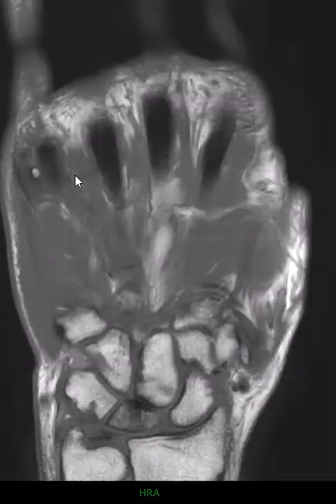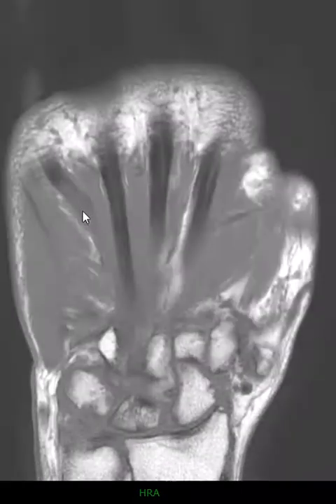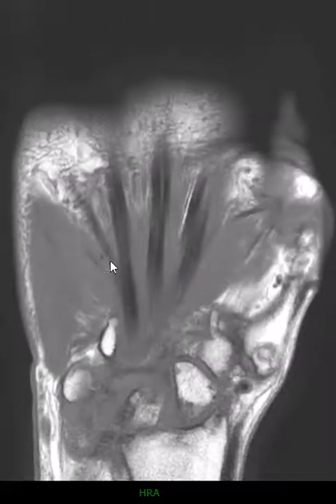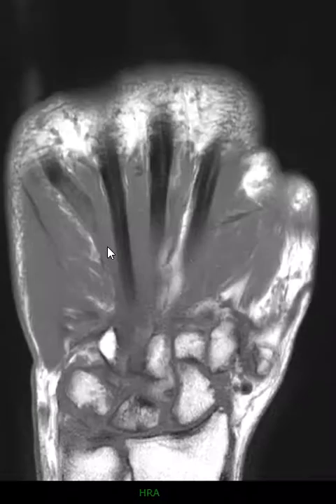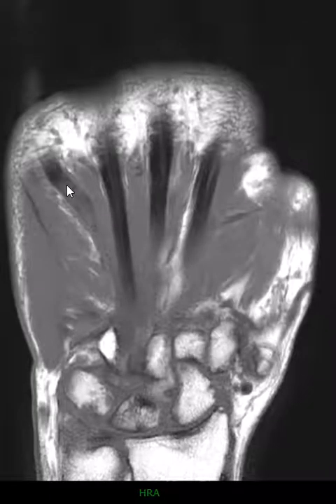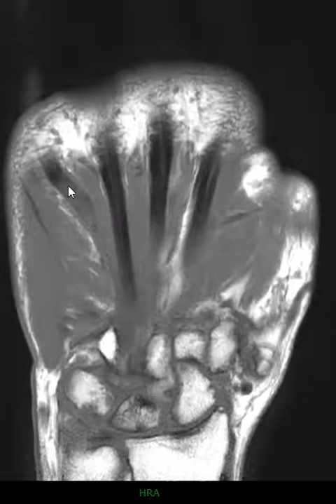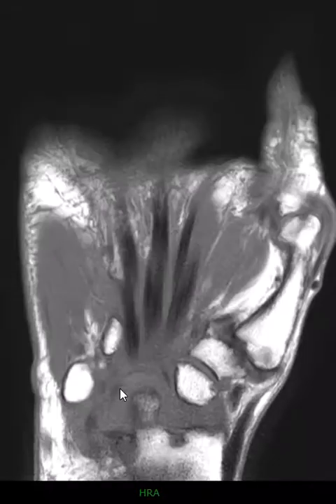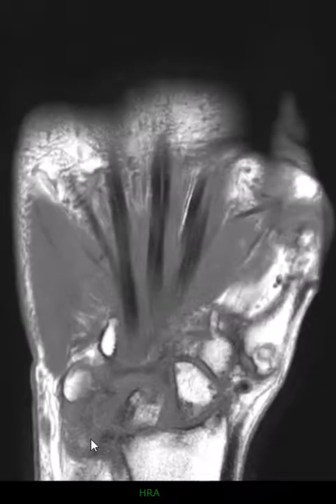And when we get to the fifth one, this doesn't look quite right — it looks gray right in here. We don't see that straight dark tendon. We see a little one here; this turns out to be the superficialis. But the profundus comes over here, stops right here, and this is the end of it. If we come down here we can see the proximally retracted portion.